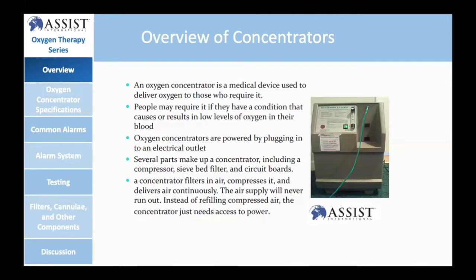Just to start, a concentrator is, in short, an oxygen therapy medical device that's used to deliver oxygen to a patient or to someone who needs oxygen.